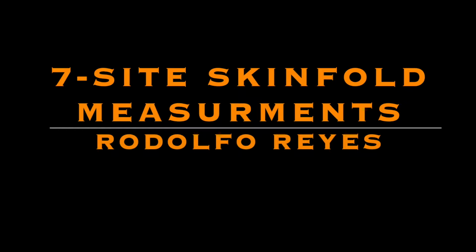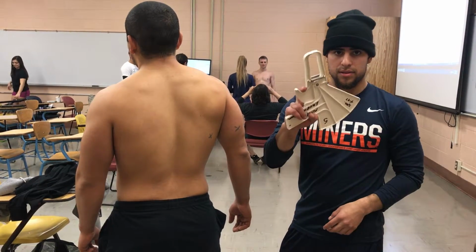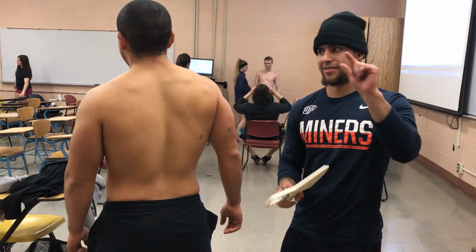To correctly assess body composition via skinfold measurement, you must be aware that all 7 sites are measured on the right side of the body. The client's skin should be dry and lotion-free. Then identify and mark all sites prior to measurements being taken. Hold the caliper in your right hand with the dial facing up. With your left hand, firmly grasp the designated skinfold site between the thumb and index finger.